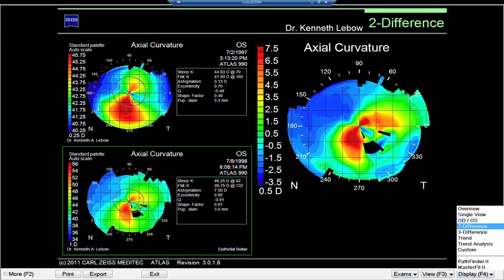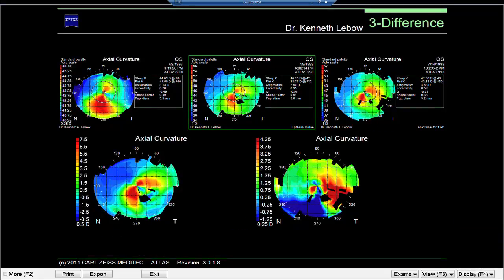I put this individual on Muro Drops to try and eliminate the corneal swelling. Looking at the change over time in the three-difference map: the original image, then the image with swelling showing steepening and flattening just like keratoconus would, then a week later with the patient using hypertonic saline to pull out fluid and reduce swelling — and we're still getting steepening. So I'm starting to think more and more that this individual has keratoconus.